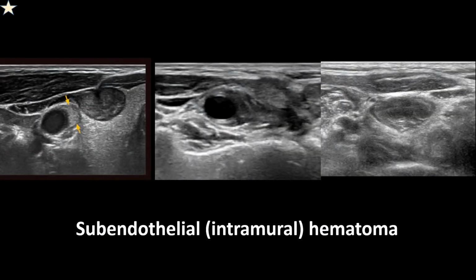This represents a subendothelial hematoma, and if the needle was located near the carotid artery during the procedure, you must always check the carotid artery afterward to ensure that there is no abnormality.